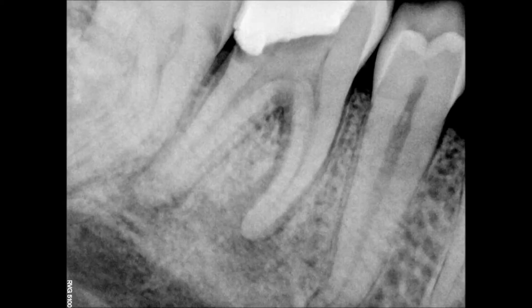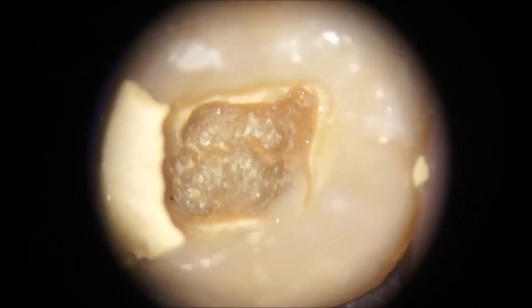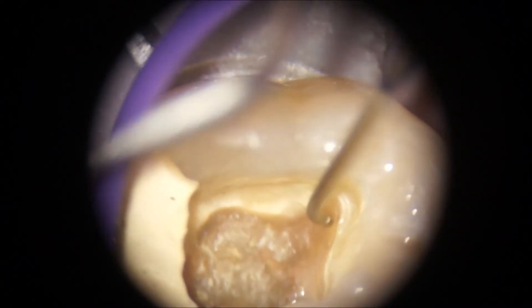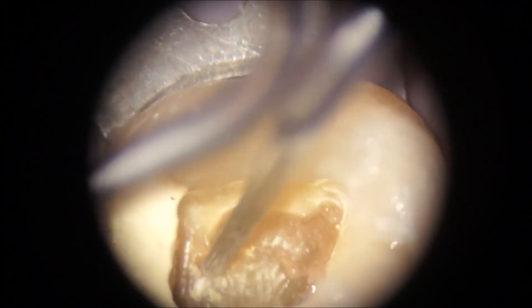The pre-op x-ray doesn't really show the extent of the calcification, but if you look at it through the microscope you'll see it is blocked quite solid. The patient was referred because the dentist couldn't locate canals, and as always the patient was in extreme pain. We also had a little pus in the area of the mesiobuccal canal.